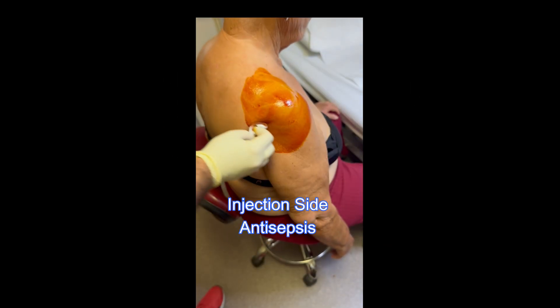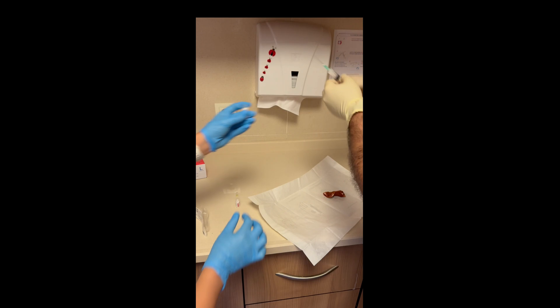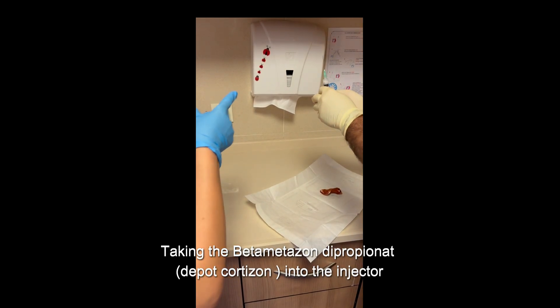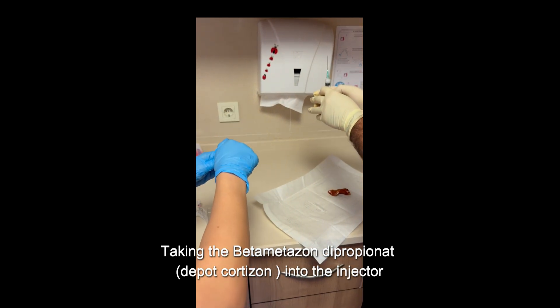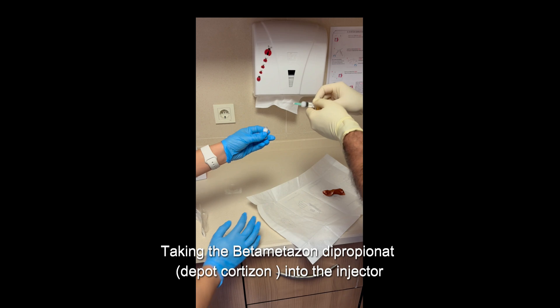Injection site antisepsis. Taking the betamethasone dipropionate — Depocortisone — into the injector.